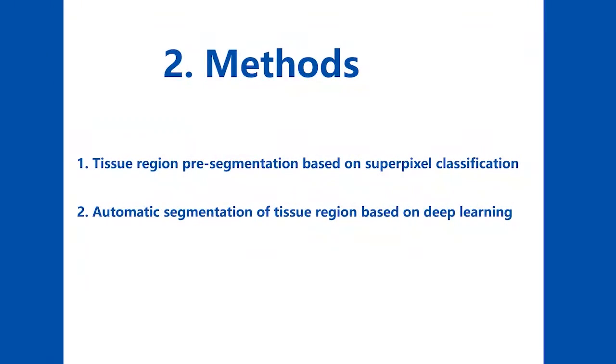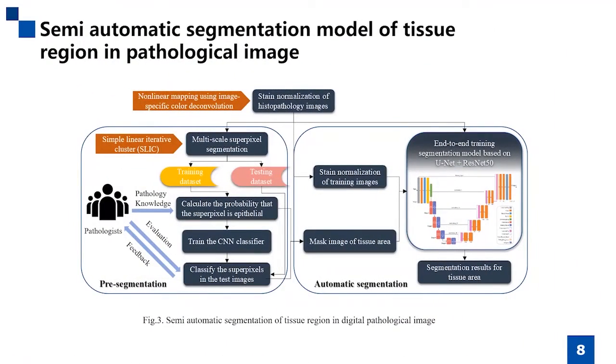The second part is the core of our paper. A semi-automatic segmentation model is proposed for tissue segmentation. This figure shows the flow of the semi-automatic segmentation model.